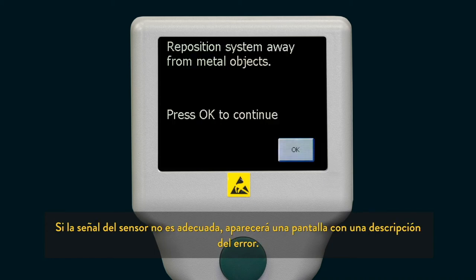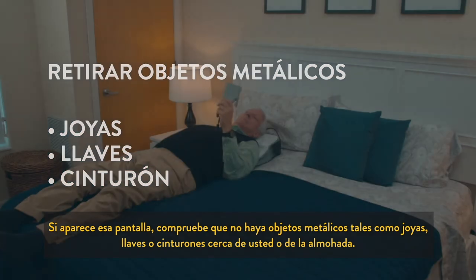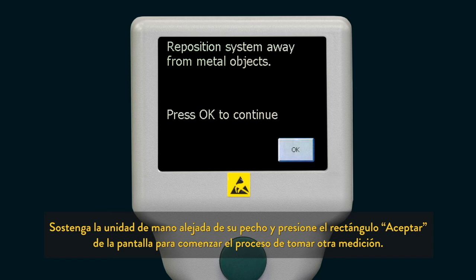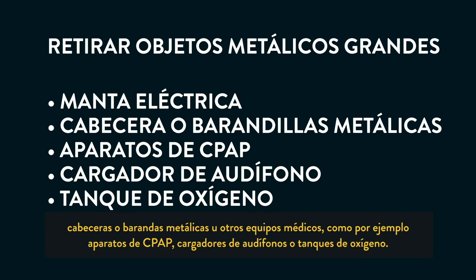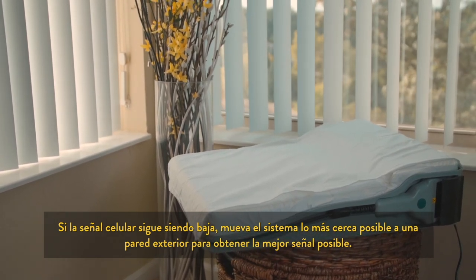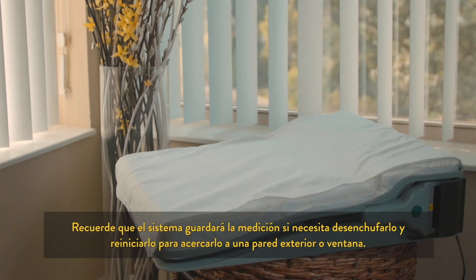If the sensor signal was not adequate, a screen will appear describing the error. If this screen appears, ensure that there are no metal objects such as jewelry, keys, or belts near you or the pillow. Make sure you are holding the handheld unit away from your chest and press the OK rectangle on the screen to start taking another reading. If this issue continues, consider larger items in the immediate vicinity of the unit such as electric heating blankets, metal headboard or rails, or other medical equipment such as a CPAP machine, hearing aid charger, or oxygen supply. If the cellular signal is low, move the system closer to an outside wall to get the best signal. The system will store your reading if you need to unplug it and reboot in order to get it closer to an outside wall or window.